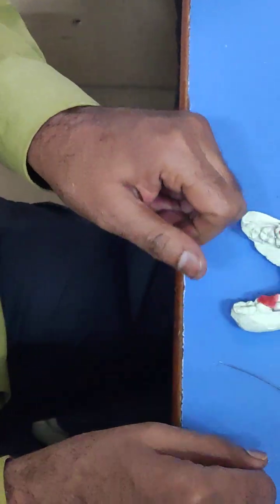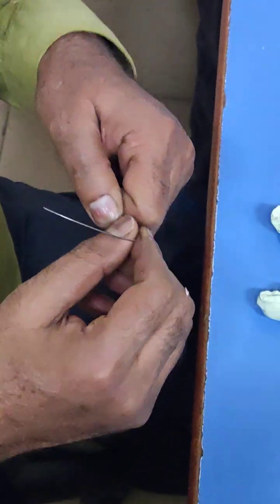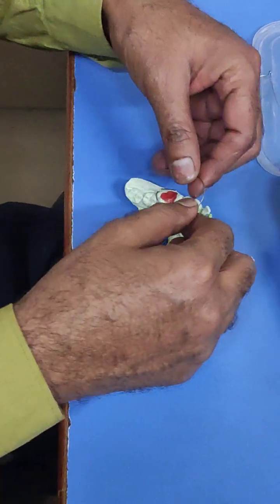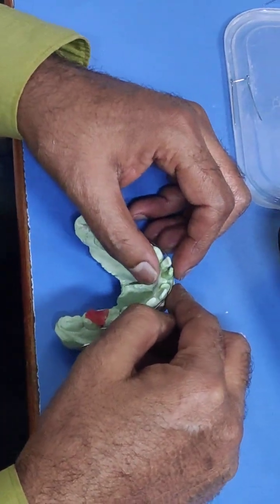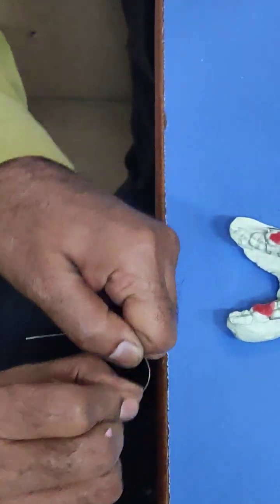Same. Check the plane first. Now bend it again slightly from the canine region.